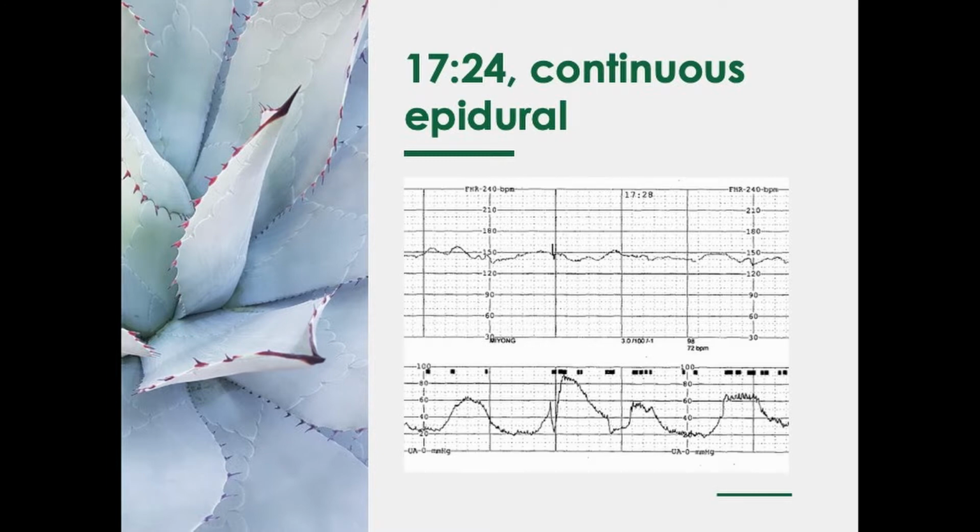If it's not present, does it tell you anything? No. Okay, so the absence of accelerations does not mean acidemia. But at least at this point in this fetal heart rate tracing, because of the presence of an acceleration, we can say there is not acidemia.